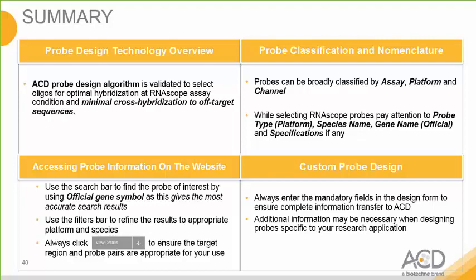Thank you, Mindy. We will now quickly recap and summarize the sections discussed during this webinar. In our probe design technology overview section, we learned that the ACD probe design algorithm is validated to select oligos for optimal hybridization at RNAscope assay conditions and minimal cross-hybridization to off-target sequences.